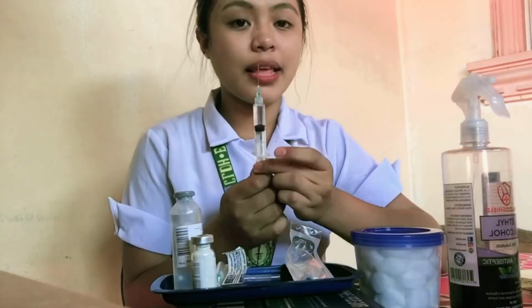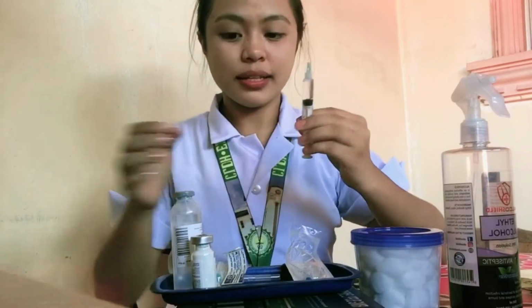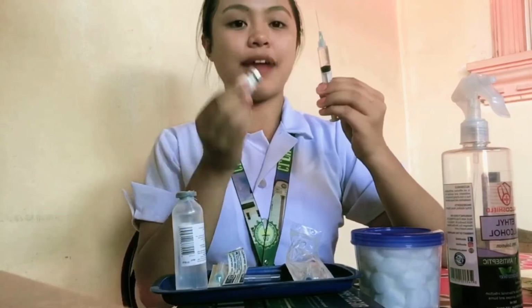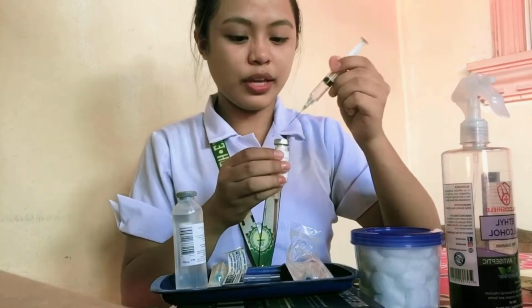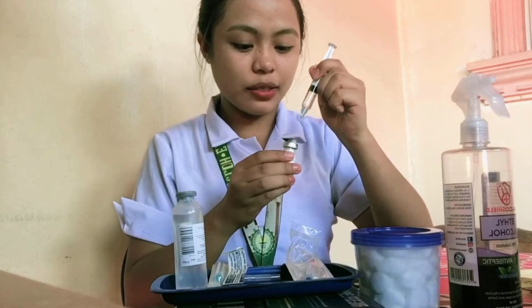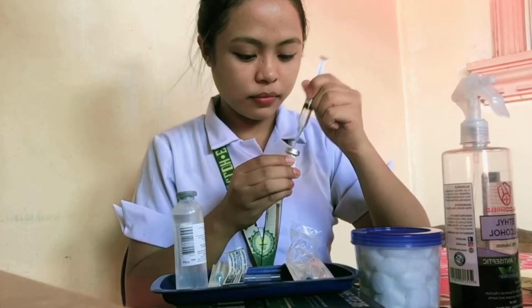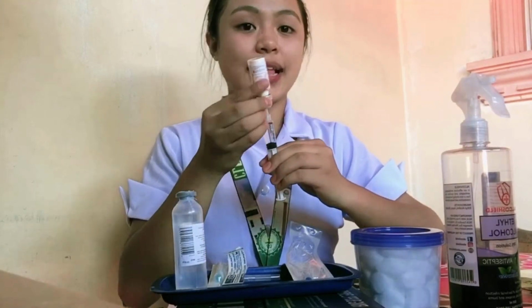After getting 3 ml of sterile water, we need to inject this into our vial. We inject it carefully and firmly at the center at the top of the vial. So don't forget the eye level.